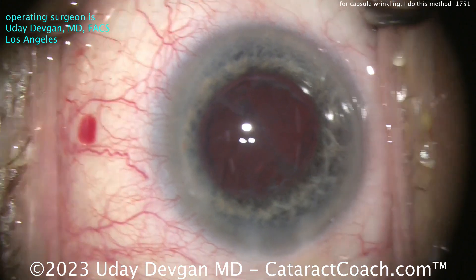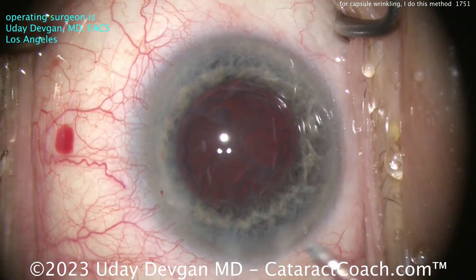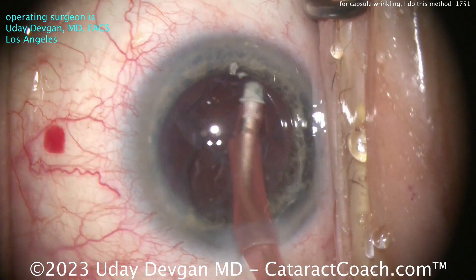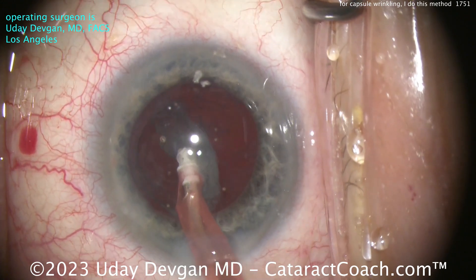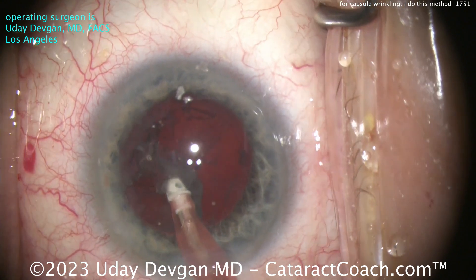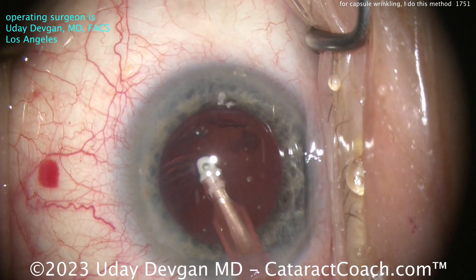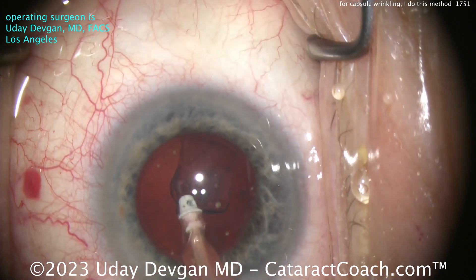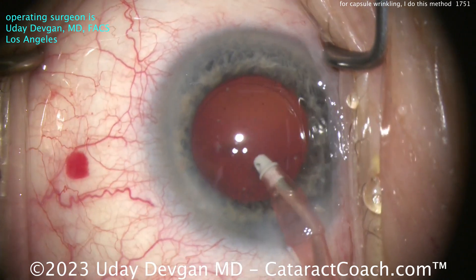Now over to the IA probe for cortex removal. Because I saw that global zonular laxity, what am I going to look for? Make sure the rhexis doesn't move. Think about it — if the rhexis is moving as you're taking out cortex, that means you're pulling on weak zonules or there's really weak zonular support. So I'm watching the rhexis edge as I take out the cortex — it looks pretty good, looks stable. I'm happy.